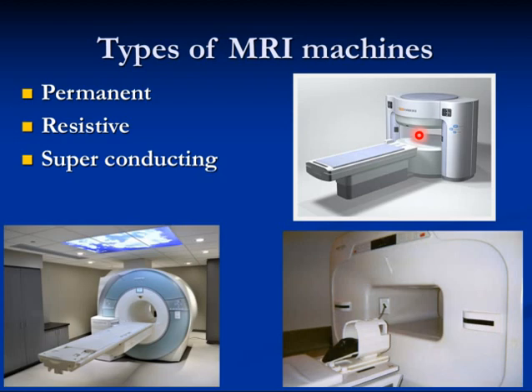Done. We'll talk later about the types of the surface coils. Just to know now, every imaging, you need a coil. We'll talk about it later in details. But just to get it out of the way, every imaging, brain, knee, lumbar, cervical, shoulder, whatever you like, you need a coil to receive the image, receive the information. Okay? So there are a lot of types of surface coils, hundreds of types. Every company makes its own, and each one has advantages and disadvantages.